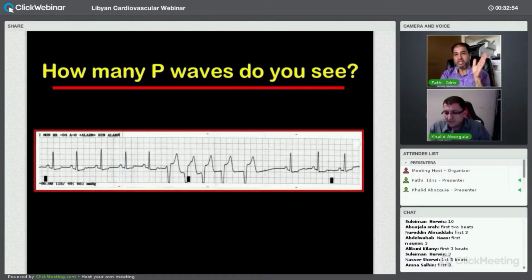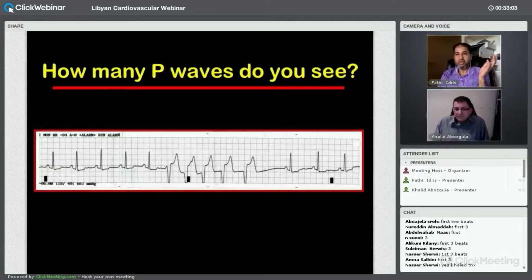Unfortunately, based on the EKG, and this is an EKG session, I don't think there is a way you can tell the change when the chronic changes are there. They rarely regress. So when you get acute on top of chronic, your suspicion should be clinical. I don't think you can see further changes on the EKG, because the right atrium is big and the right ventricle is big. In that very case, in fact, she had a CT scan of her chest because of the possibility of pulmonary embolus, and it was negative. The CT scan was immediately before they did the echo, and when they did the echo, everything was big and large. But that's a good possibility.